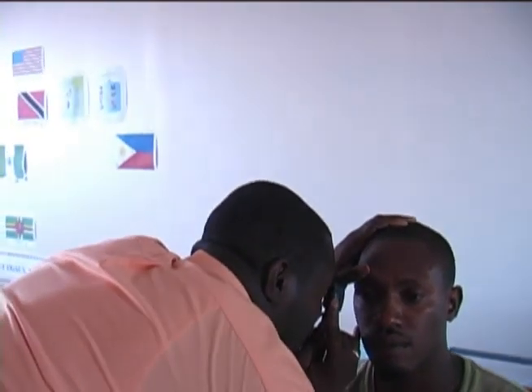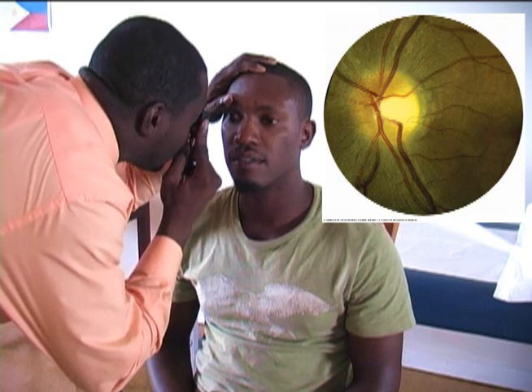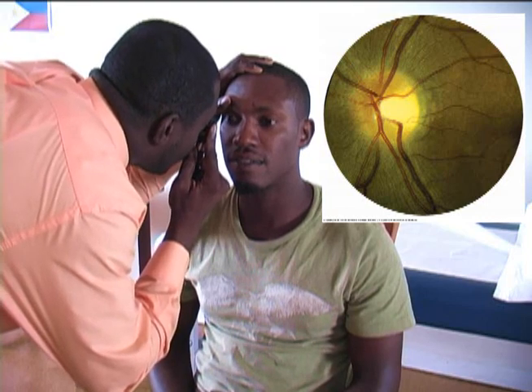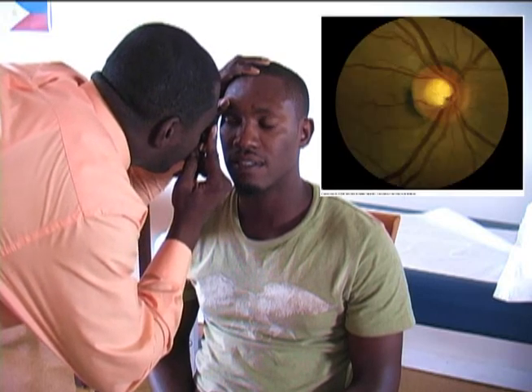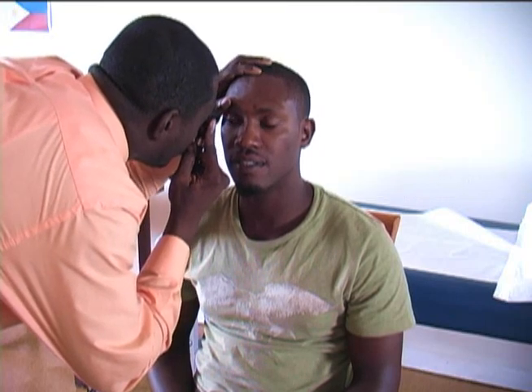Observe the optic disc and cup. Follow the vessels to each quadrant of the retina, noting the state of the arteries and veins and the background appearance of the retina. When this is complete, ask the patient to look directly at the light. Observe the macula and fovea. Note that the macula is temporal to the optic disc. Hold the ophthalmoscope with the other hand and repeat the above steps and examine the other eye.